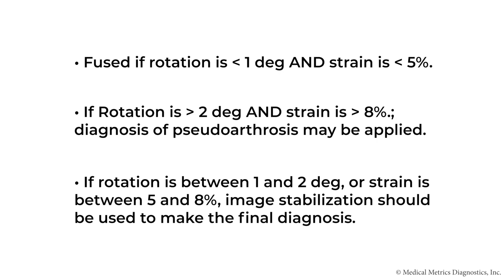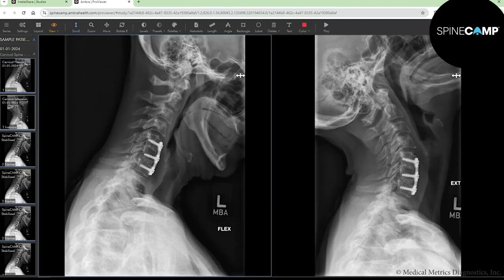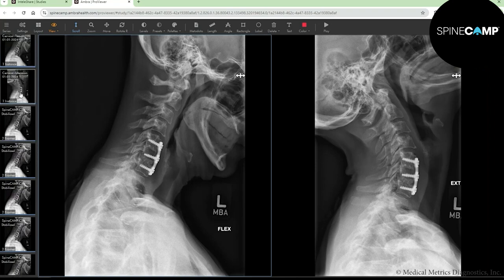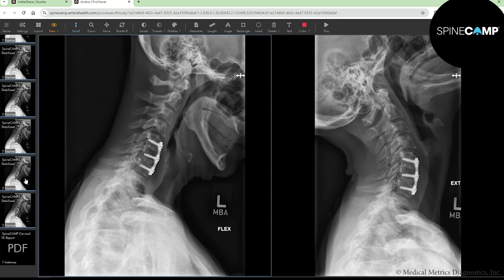I'm going to use results from SpineCamp and a standard DICOM viewer to demonstrate how to apply this protocol. Here we have a web-based PACS hosted by Intelerad, preloaded with two sample patients treated with ACDF. The SpineCamp results have already been obtained from the fully automated AI software as a medical device. We have a flexion image on the left and an extension image on the right for a two-level ACDF. In the ribbon on the left, SpineCamp data is already available, including stabilized images for every vertebral body from C2 to C7, as well as a SpineCamp cervical FE report.